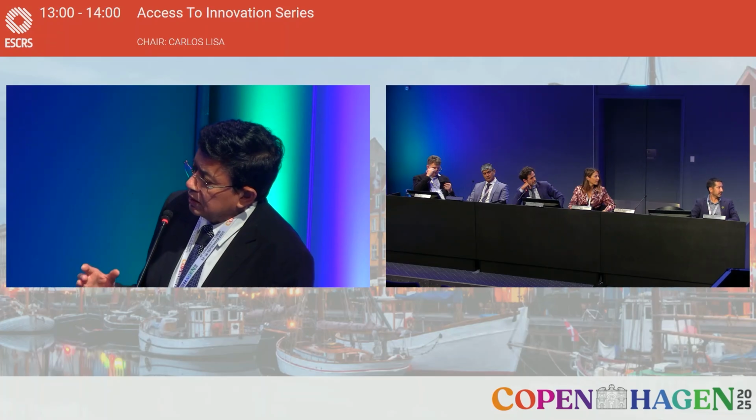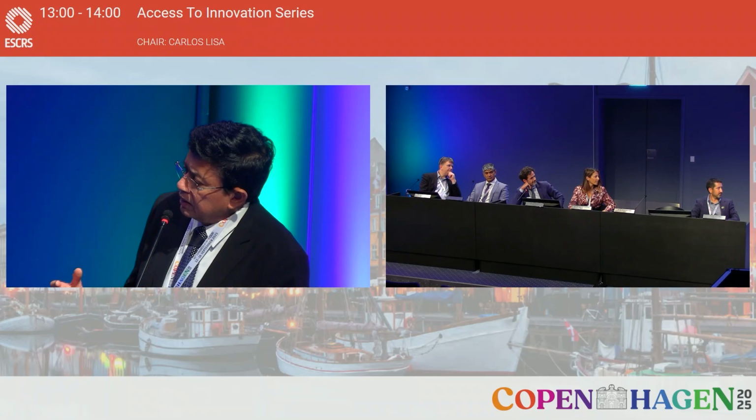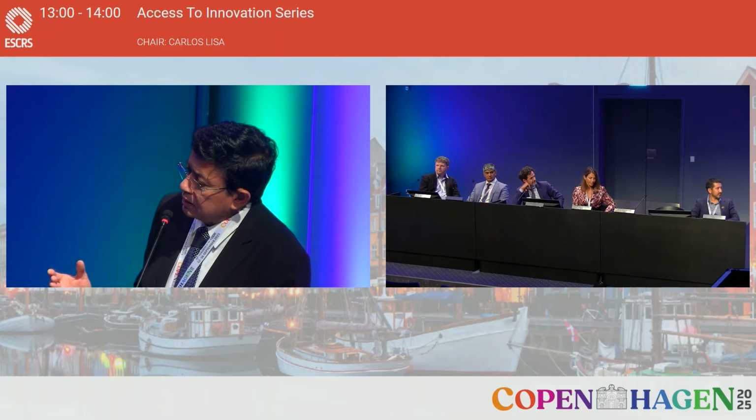So if a patient wants a true trifocal intraocular lens, then if you hit emmetropia with a good quality lens, distance, near and intermediate is taken care of. But the dysphotopsia is a problem which tends to go away in most patients. There are some who get bothered, especially if night vision, night driving, etc. is important for them.